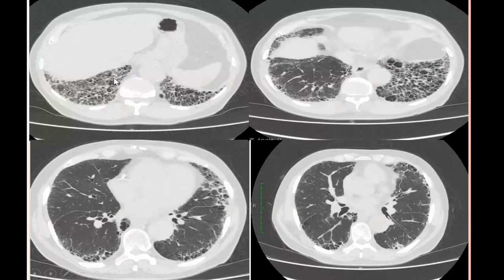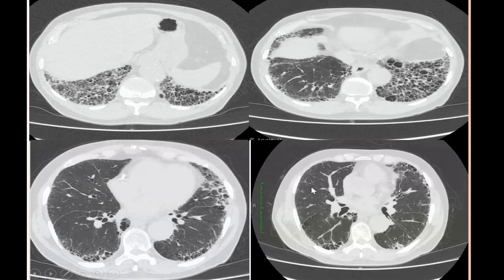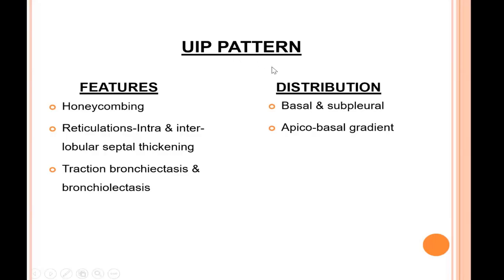This is a case of a 70-year-old male presenting with progressively increasing breathlessness. We see significant honeycombing in the basal segments — cystic spaces sharing their walls, piled up on each other, known as honeycombing. We can see honeycombing in the lower lobes in sub-pleural regions, while the upper lobes and apices are relatively spared. This is the classical UIP pattern, with an apicobasal gradient: apices spared and predominant basal and sub-pleural involvement.